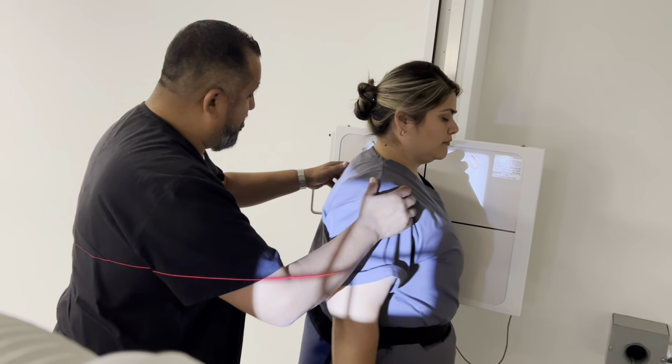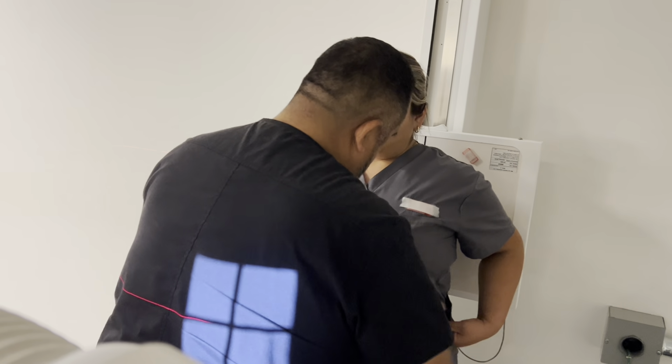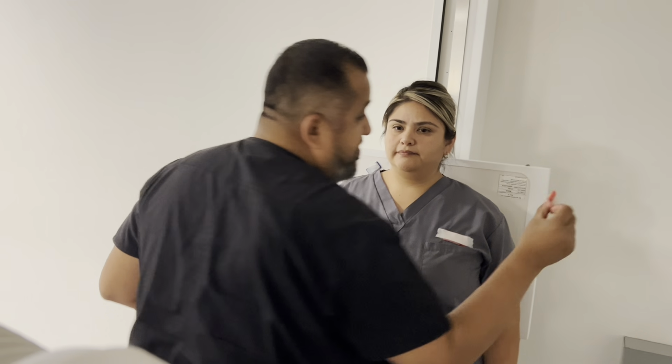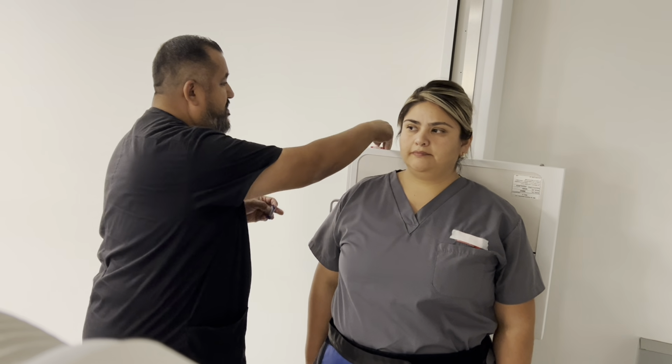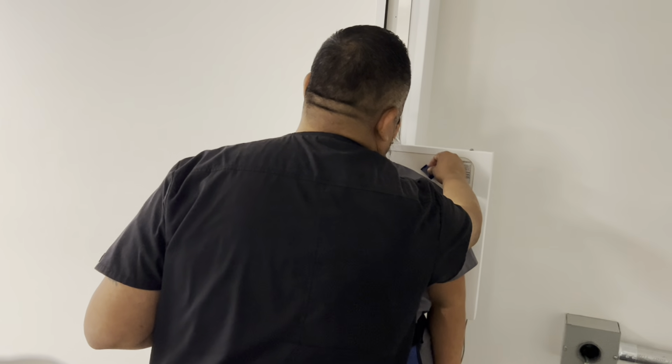So now we're going to have you turn, put your back against the board. We're going to turn the shield, and put it in the front here. There we go. Okay, so let's go ahead and start off with an LPO position. Notice I have to take away my markers. All right, I'm going to put my left marker over here on this side, and if I have to make adjustments, I will.